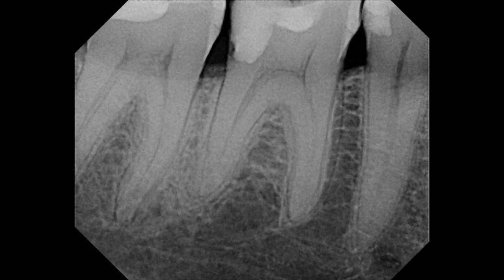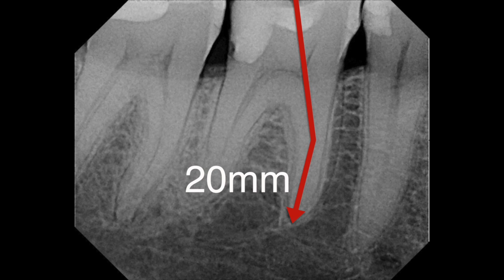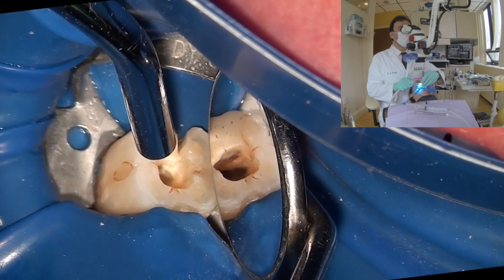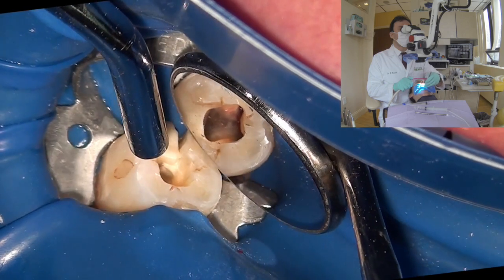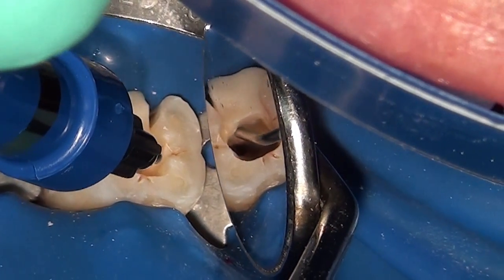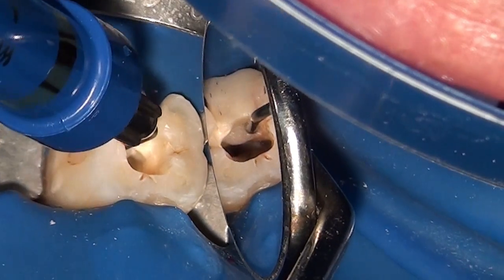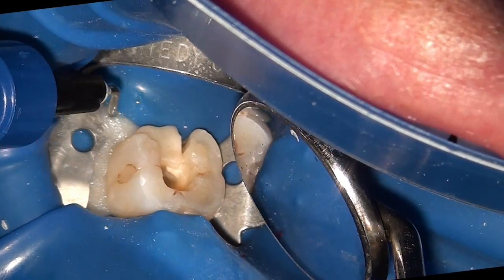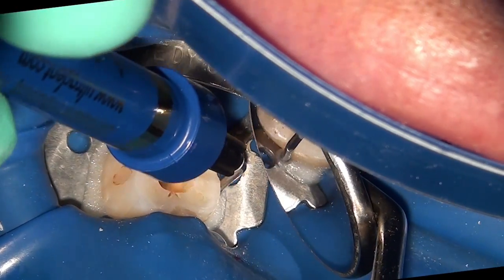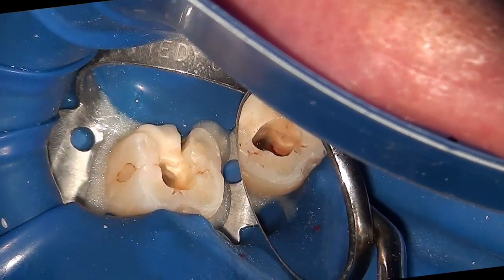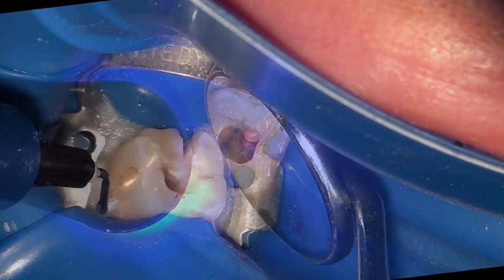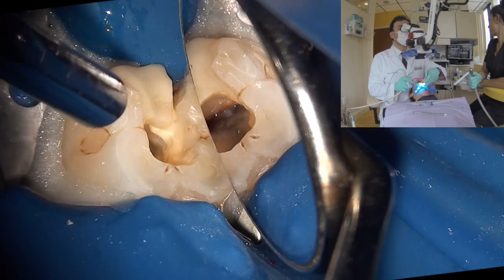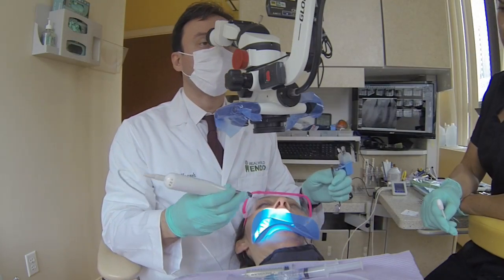As usual in these types of cases, we first determine the estimated working length — here we estimate it to be 20 millimeters. I've skipped through the access preparation, so we can see that we've just removed the coronal pulp and you can see the orifice of the canals. Then I proceed to place this caulking material to seal any potential short circuits that may be present and could trip off the apex locator. Once the area has sealed and we have aseptic control, after curing we now have fairly good isolation and you can see four orifices in this canal.